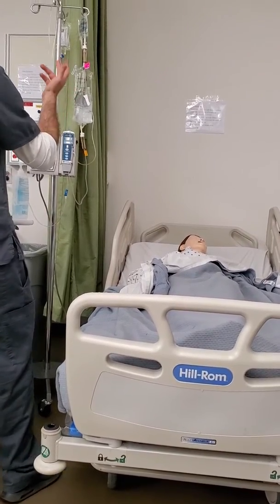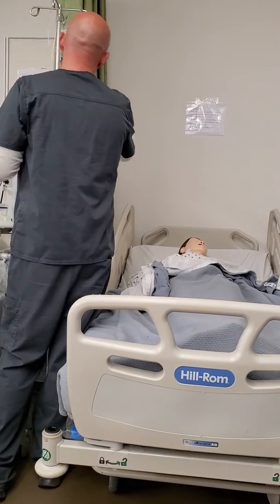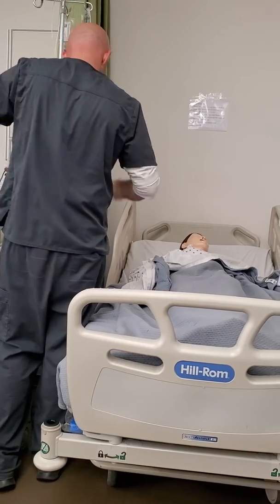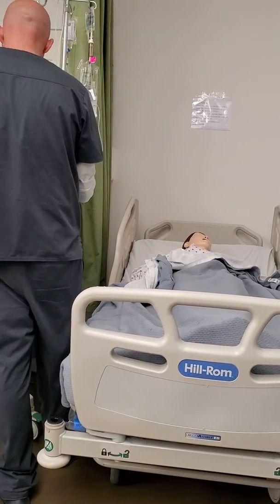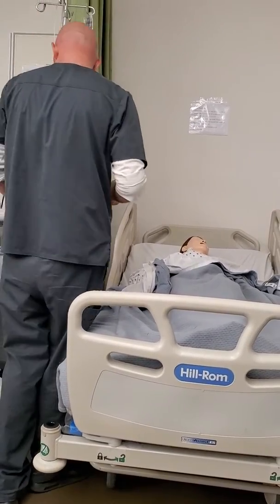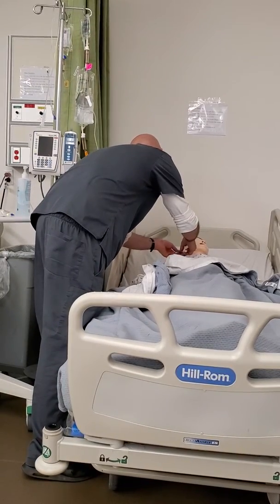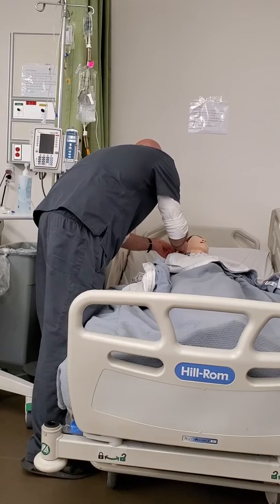So now that I have a new primary line and I'm going to be administering this antibiotic through a previously used line, first thing I want to do is flush my patient's line.